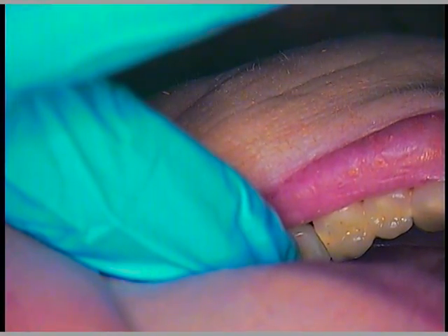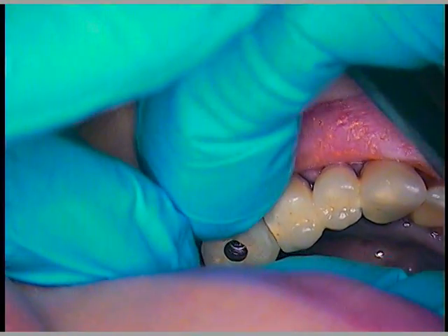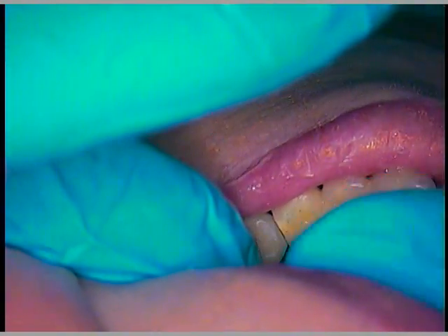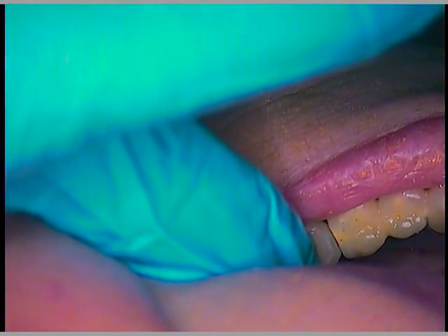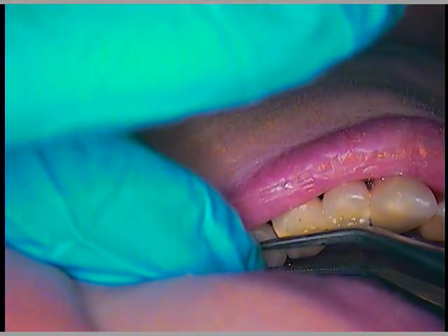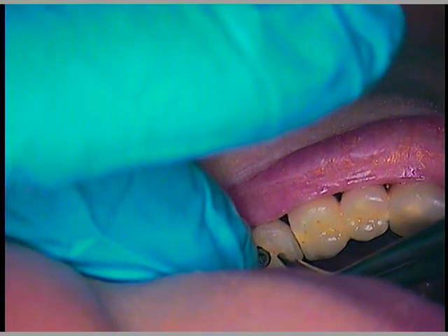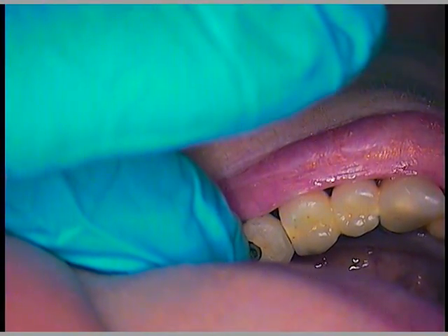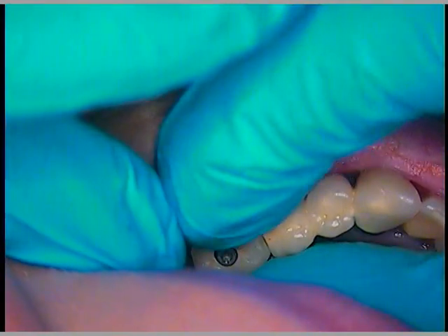I'm going to use floss as I tighten it — glide floss — to make sure the contact isn't too tight for her. The screw goes in on that angle; remember we were dealing with that with the other screw. That could be the laboratory putting the top of the first portion in on an angle. That's got a catch just right.